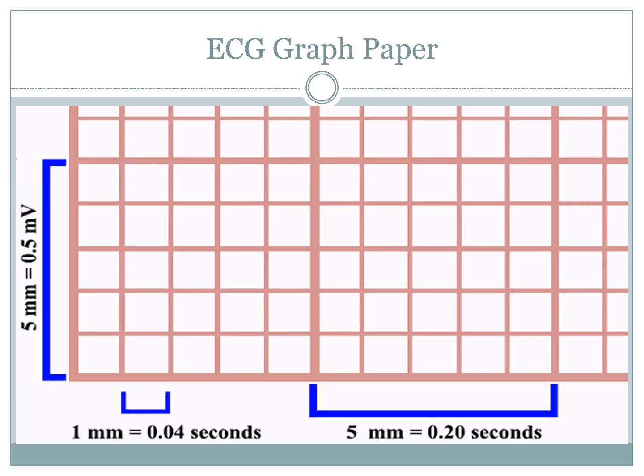The way we read the effectiveness of the heart, or how well the heart is releasing electricity or contracting, is by using ECG paper. Now things that we need to know about ECG paper is the way that they're broken up. I'm sure everybody's fully aware of how an ECG paper is broken up, but we'll just go along so it makes it easy to refer back to for the rest of this pod. If we work along the bottom axis, you'll see that that's a generation of time. The large squares, or 5 little squares, are 0.2 of a second, meaning that 5 large squares represents a second in time, and every little square represents 0.04 of a second in time.